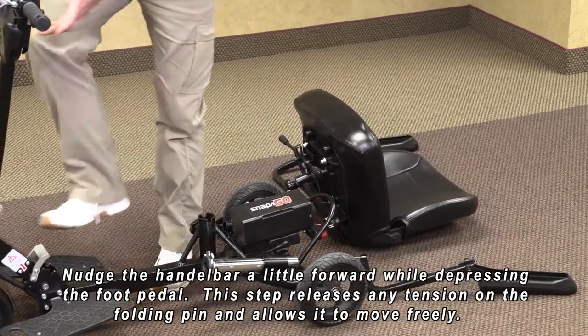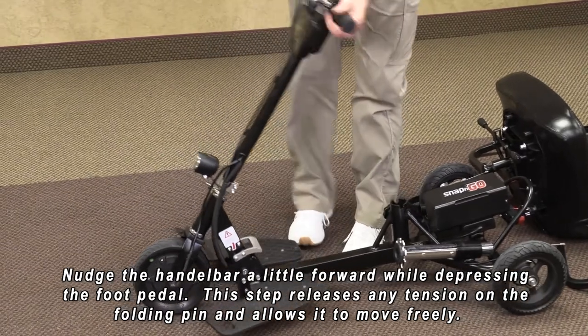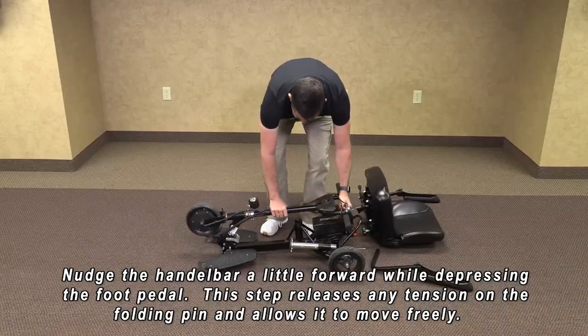Now we are going to lower the handlebars. We will hold the handlebars so they don't fall down. Depress the foot pedal. Lower it until it snaps in place.